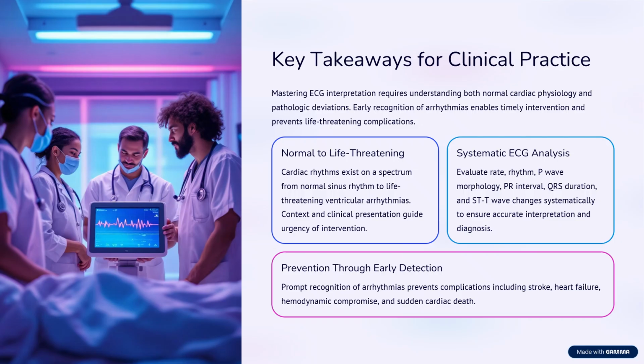Developing these skills now, practicing ECG interpretation, monitoring for subtle changes, and linking rhythm changes to patient symptoms prepares you for confident and competent clinical care. For additional practice, don't forget the link on the last reference slide to an interactive ECG platform. It's a great tool to reinforce your skills and connect theory with practice.